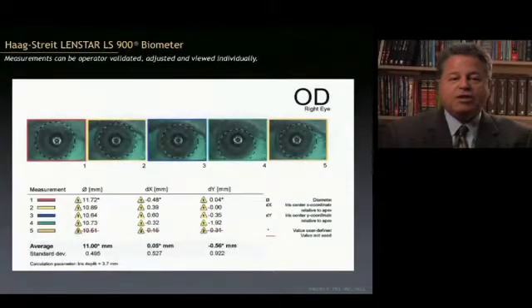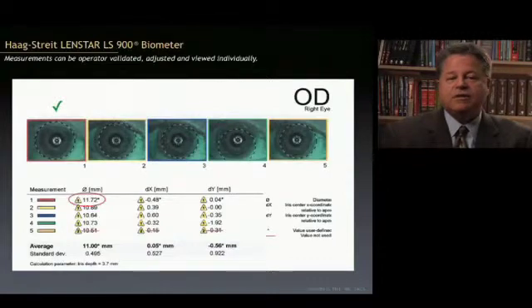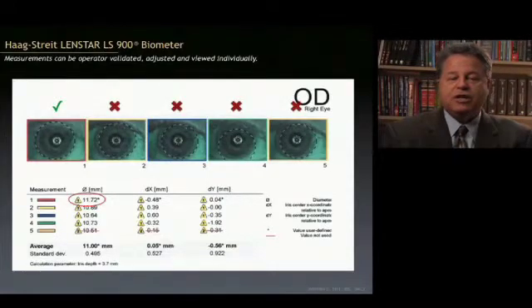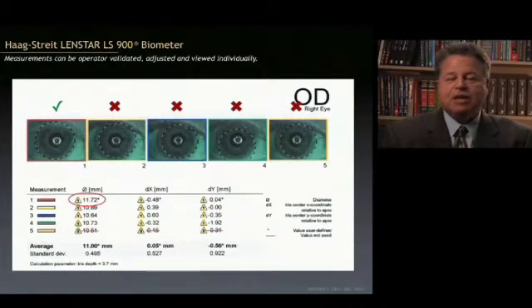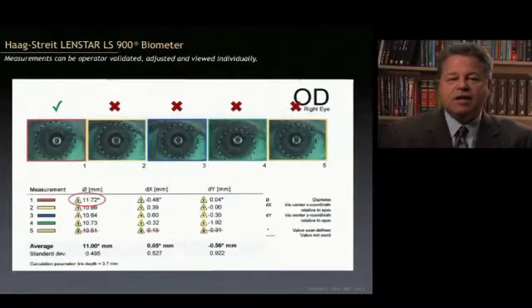Here's another way the user can adjust measurements — the horizontal corneal diameter. The reticle that goes around the limbus can be adjusted in both position and size. Here it has been sized and positioned incorrectly because this patient has a very light iris, making it difficult to identify the limbus without much contrast. The other four measurements were incorrect, and the first one was adjusted by the operator to give the exact measurement. The operator has access to all measurements and can validate and adjust them.